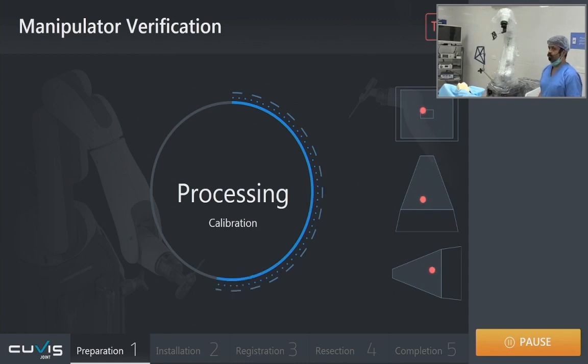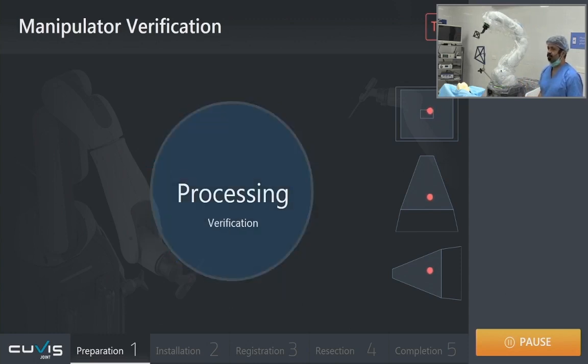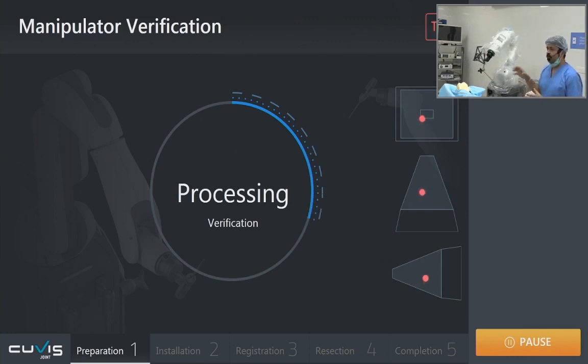whatever it needs to perform while it is going to go in the cutting mode. So before that, the calibration is a very essential step. And as you can see, the arm is continuously moving, making sure the calibration is perfect and that it works. The calibration is done, and the verification process is on. Once again, it will make all movements in various planes. Also, at this point, this is a check where, because the movement of this robotic arm is all controlled by servo motors, various servo motors are working at this stage to make sure things are in place.